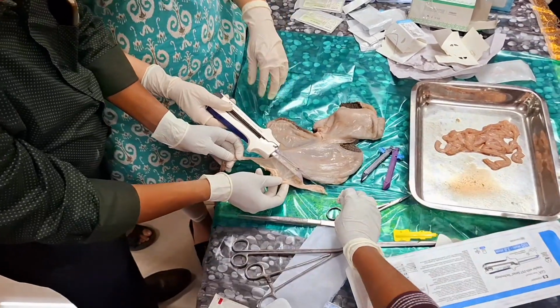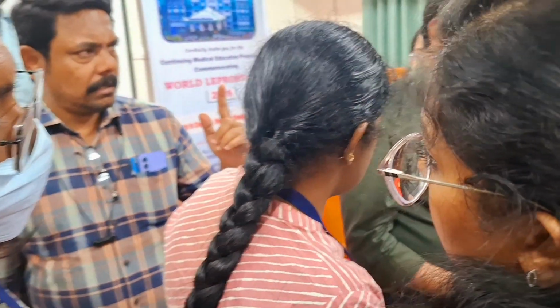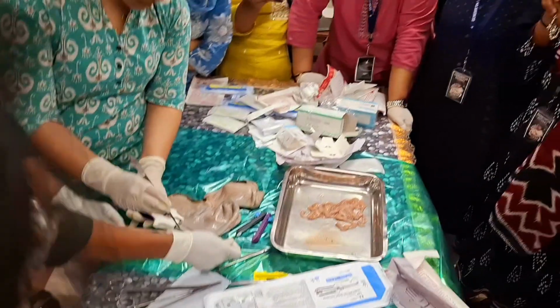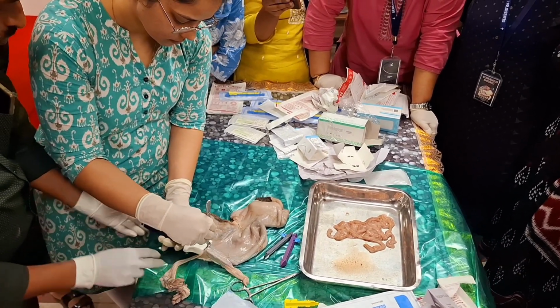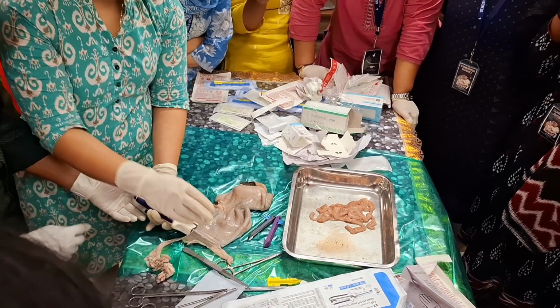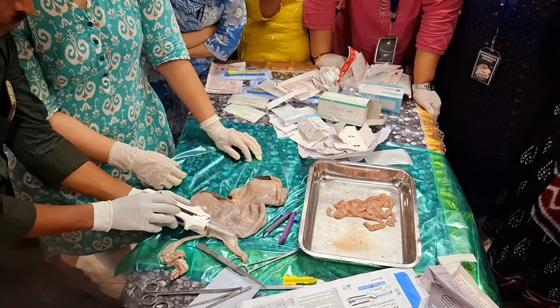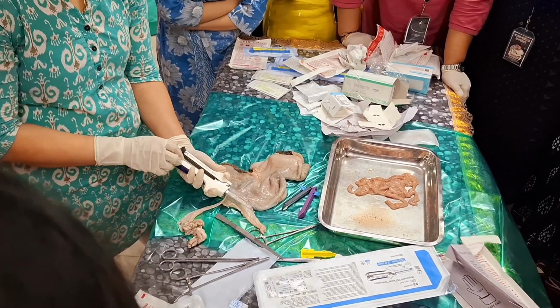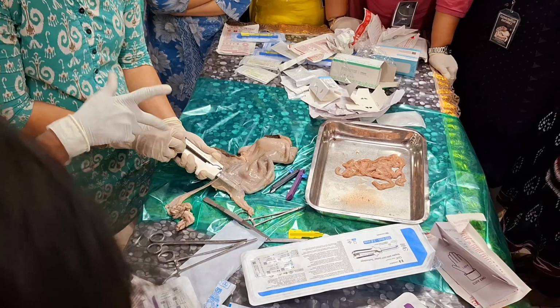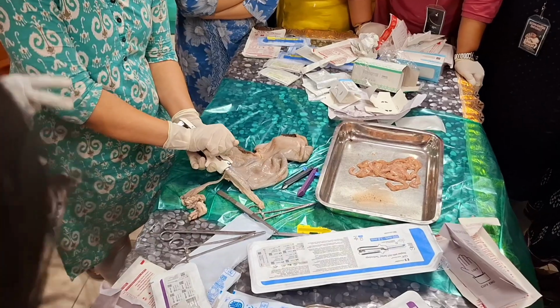Suppose it only staples, then you have not made an ostomy. There is no knife inside. Both would have been anastomosed, but you would not have made an opening. While firing, it will staple and also it will cut. You have seen that video, no? It will staple and also cut, creating a common stoma.